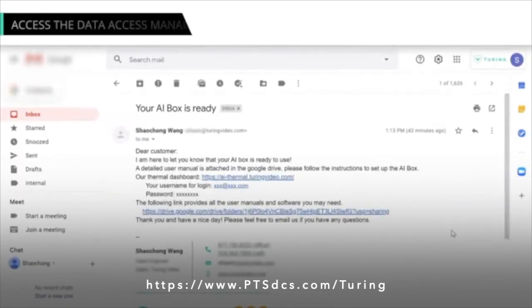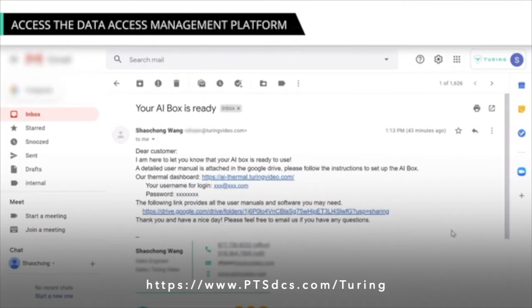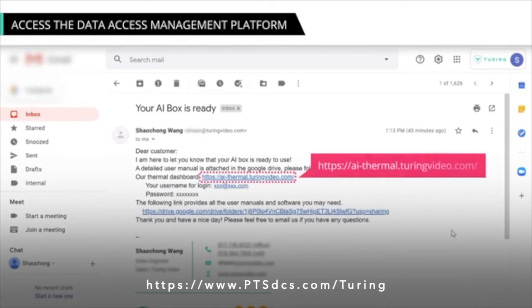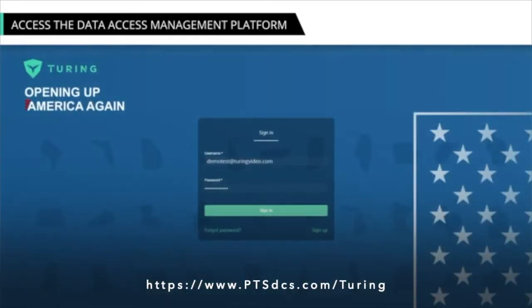Before exploring further, let us see how to access the Data Access Management Platform. Once a device is installed, you will receive an email from the AI Box team intimating that your AI Box is ready. You can use the appropriate link to access the platform. On the login page, enter your credentials.